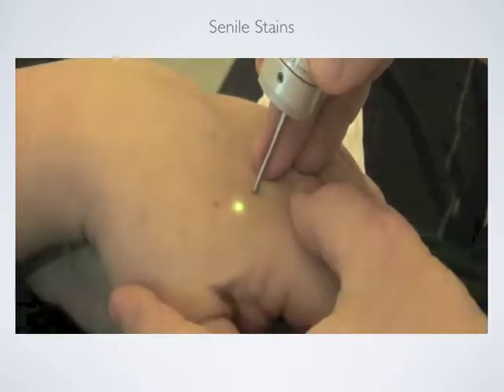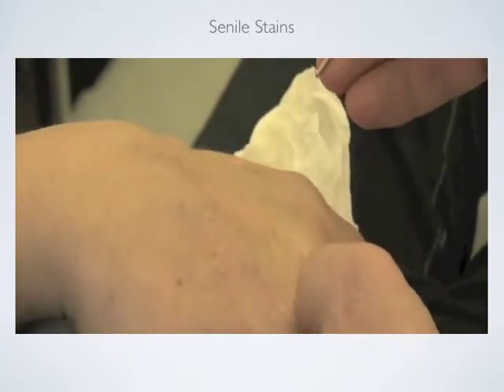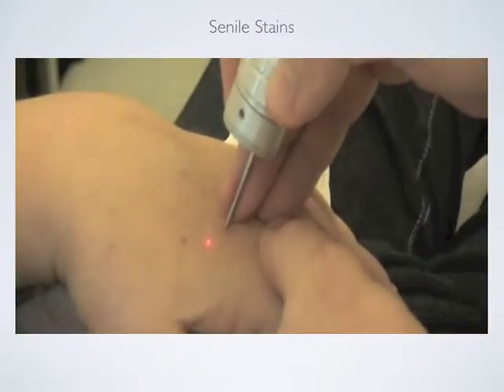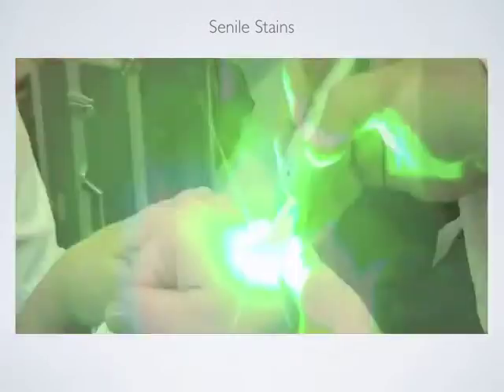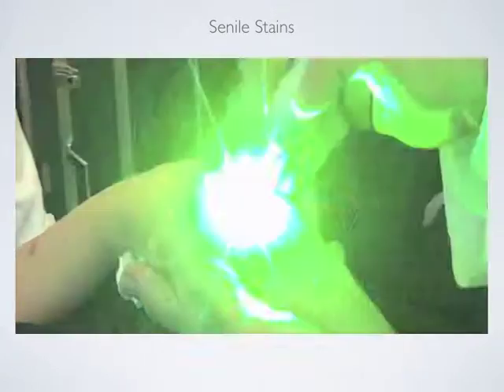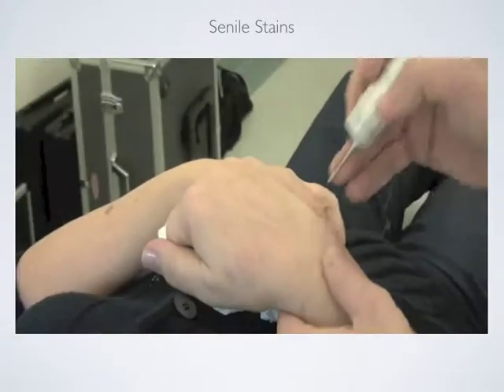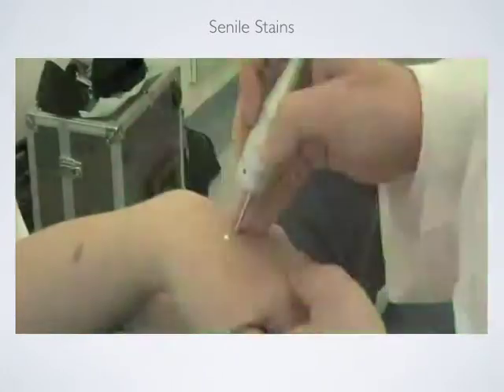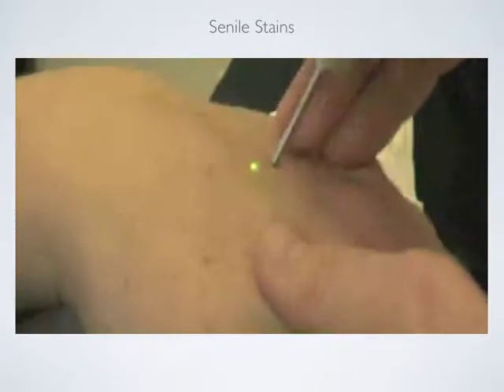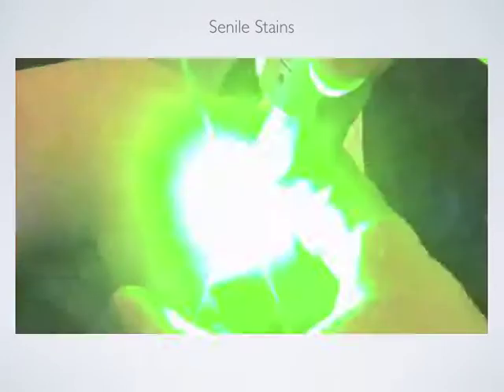Treating senile stains on the dorsum of hands is very subtle. You have to treat the whole lesion either with a scanner or a 0.5 or 1.2 mm spot. You don't need the whole power of the machine — it depends on the speed of your movements. According to it, you use a much lower setting, thus diminishing the pain sensation for the patient. All treated lesions are much darker than the untreated ones. The pain should always be tolerable. If the patient reports intolerable pain, it means that your settings are too high for that case and you should lower them. You shouldn't be worried by smoke because it comes from burning the hair shaft and has no consequences.